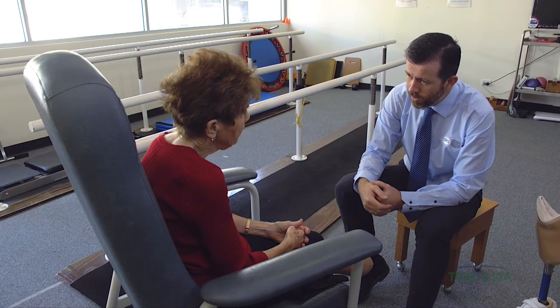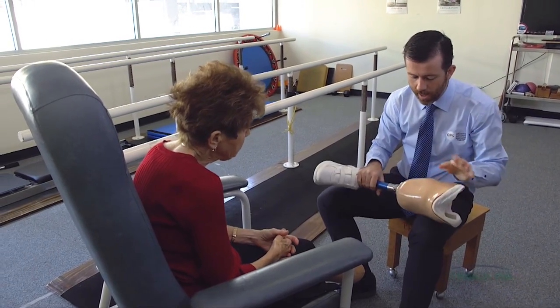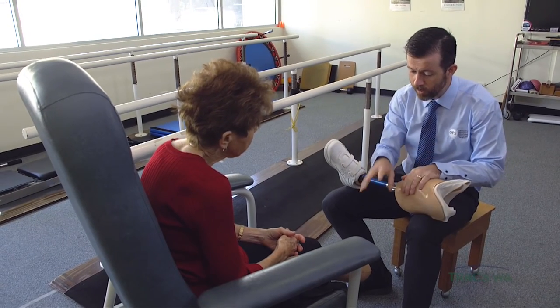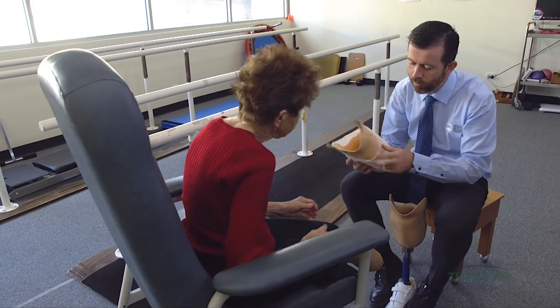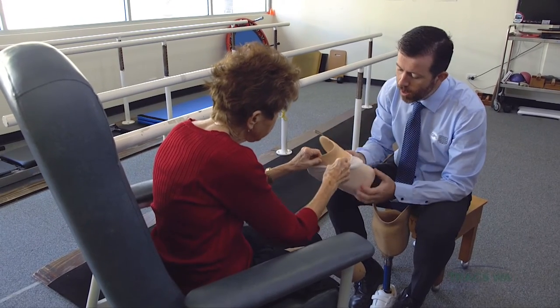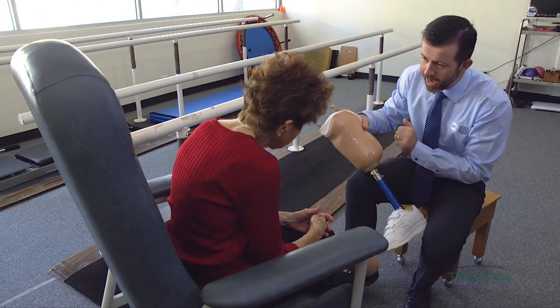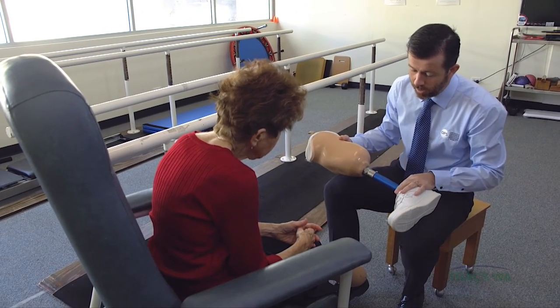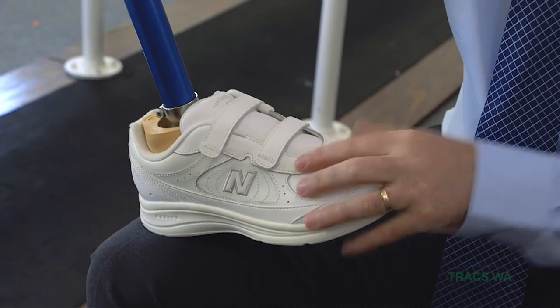Did you have any other questions about the prosthesis? Well, will it be a bit like that one over there? I've got one here to show you, Val. This is a prosthesis for someone with a much bigger leg than you. But as you can see, it's got the inner foam lining — have a feel of that. We wear cotton socks inside this liner. This liner goes onto your leg and then fits into the fiberglass socket, which is the hard part, and that connects to the components and the foot.